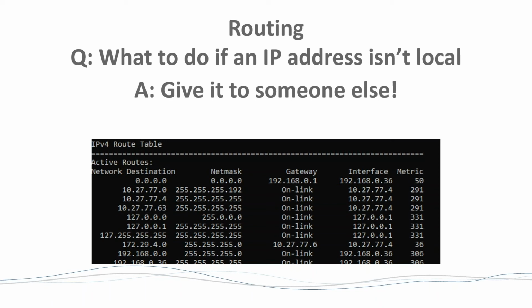Okay, so why am I telling you all this? When I get down to the bottom, I have this special net mask. From what we know about net mask, what does this mean? 0.0.0.0. It's a weird net mask, right? It's no value. It means anything goes, right? So this is your default gateway. Going to anywhere, 0.0.0.0. If you haven't matched to this point, I want you to send it to the default gateway, which was configured when I configured the device, I put in 192.168.0.1. Does that make sense? Any questions on that? That's how routing works on a device.